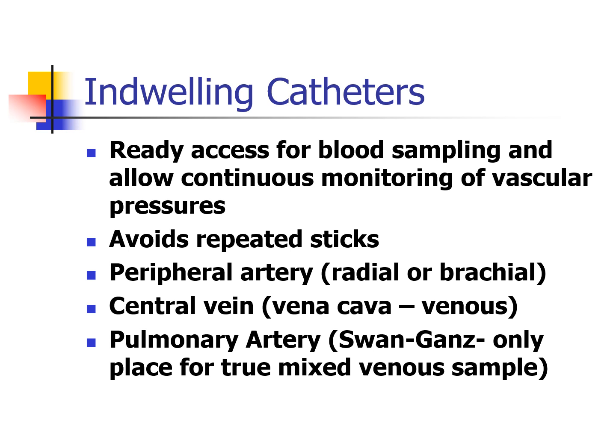Understand there are patients that will have a femoral A-line in place and they cannot bend at the hip. So if their head of bed needs to be elevated, their whole bed has to be straight. They cannot bend at the hip because there is a thing that would occlude their femoral artery if they bend at the hip. So just understand that.